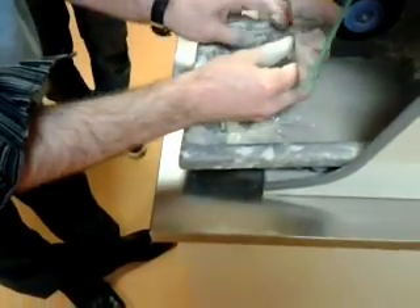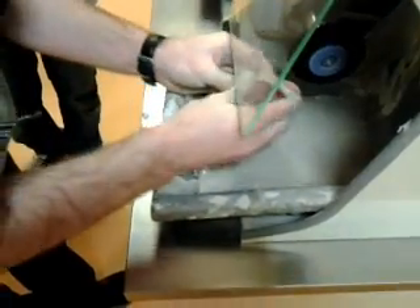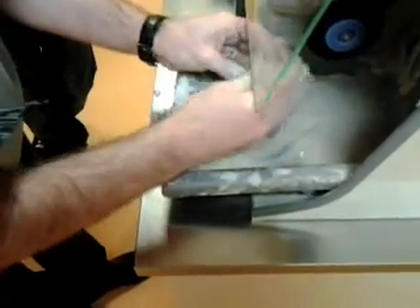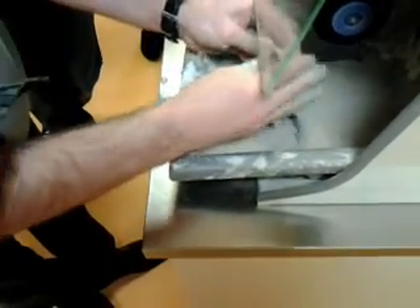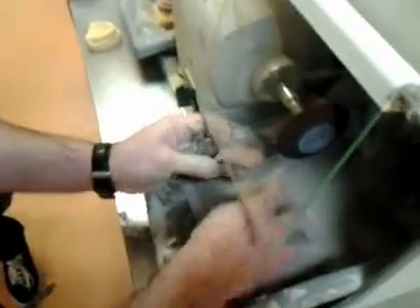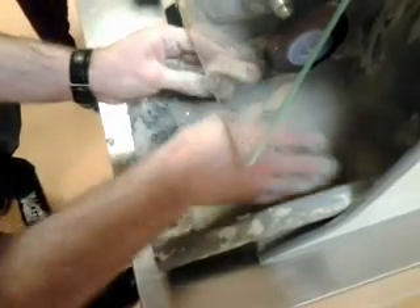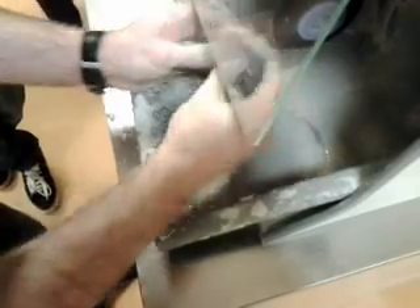Ensure you have a good coating of pumice at all times on your denture, and keep the denture moving about. Don't hold the denture in one place because you'll burn it. You want to achieve a nice smooth matte finish with this.